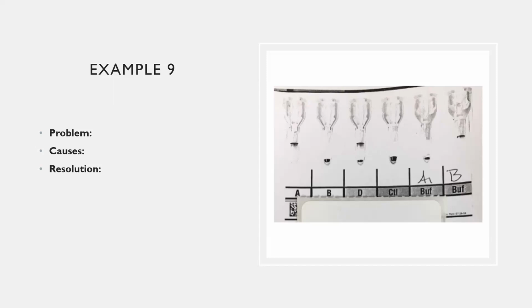So if you have a monoclonal anti-D, it could be specific to just epitope 3. So if you have one of the partial Ds, it's not going to detect a partial D. But if you have a blend of D, it's going to have anti-1, anti-3, and these are not real names. There are specific names for these antibodies. This is just for simplicity's sake. We're going to talk about this more next session. But partial Ds are qualitative. They can make anti-Ds. Weak Ds are quantitative. They cannot make anti-D.